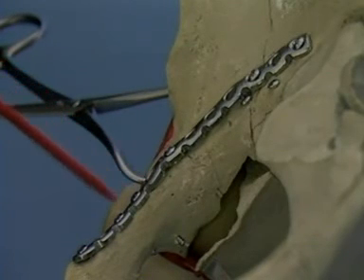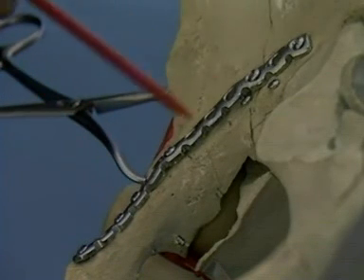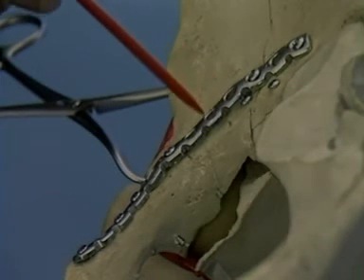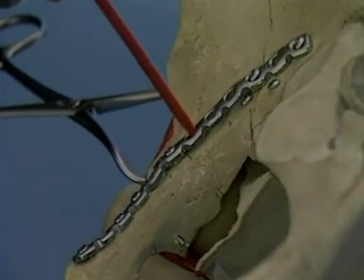It's not necessary to fill all the plate holes. In fact, several holes must be left open for a posterior column fixation following the reduction.